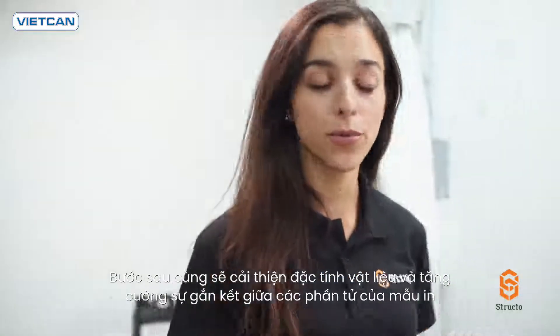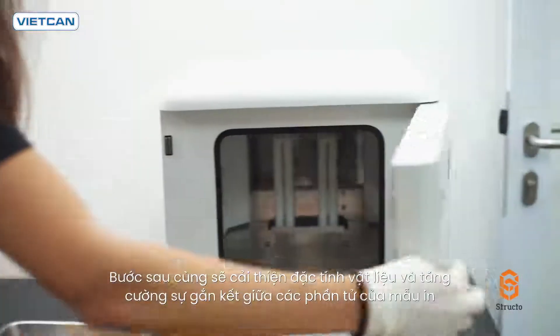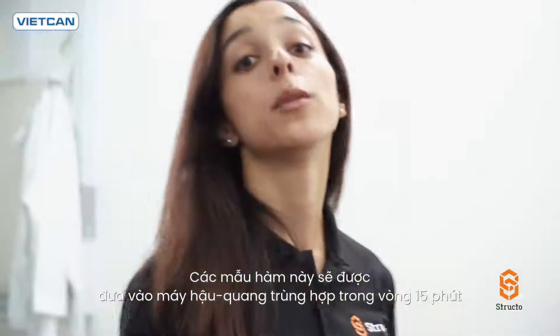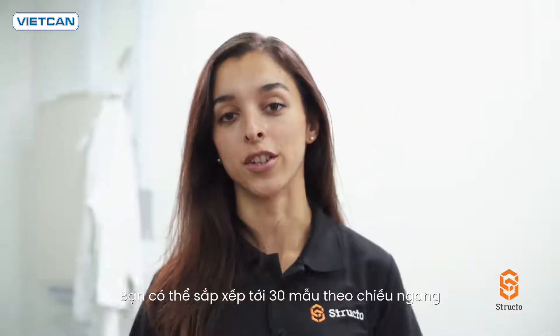The last step will further improve material properties and strengthen the bond within the printed part. These models will now go into the post-curing unit for 15 minutes. You can fit up to 30 models horizontally.